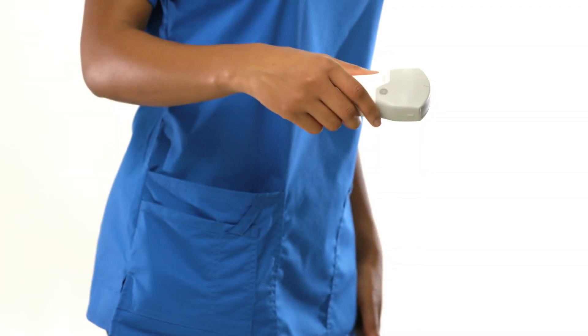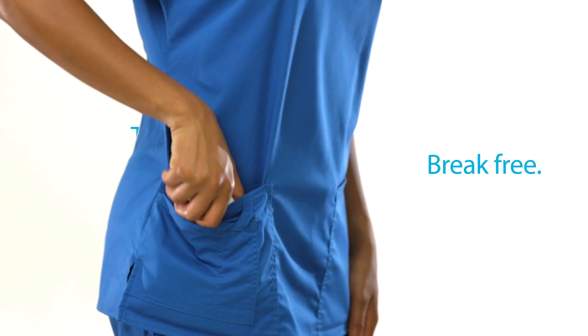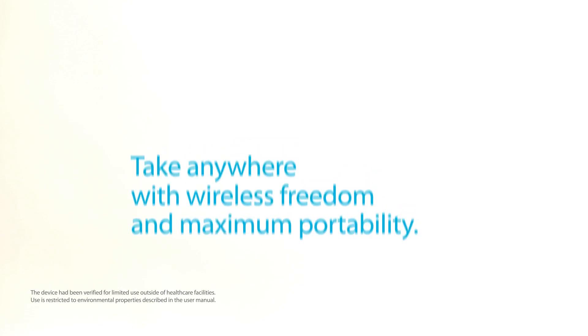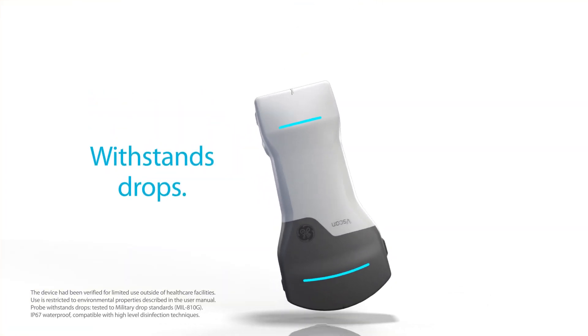Wireless and almost as light as a smartphone, carry it in your pocket and take it wherever you go. Designed for the rigors of your clinical environment to withstand everyday handling from scratches to drops and even a rainstorm.